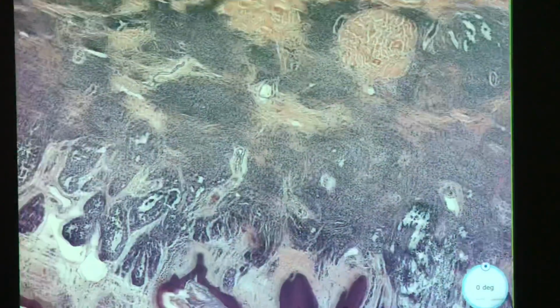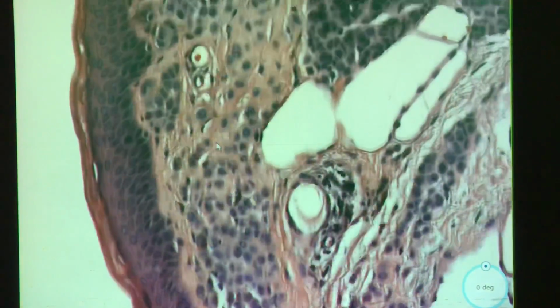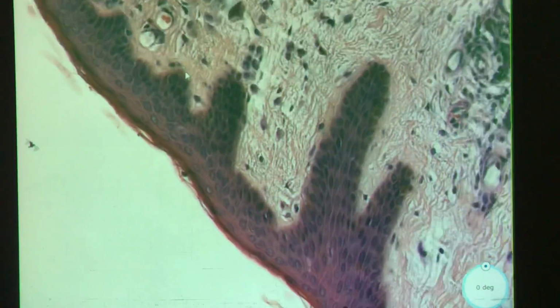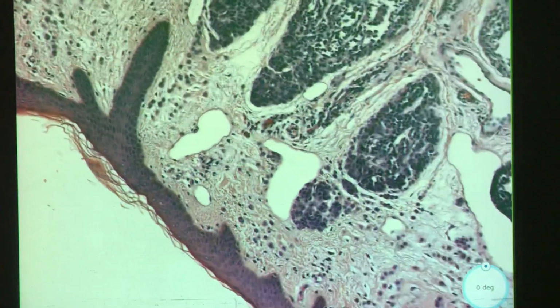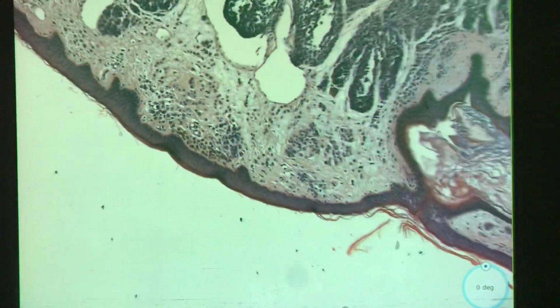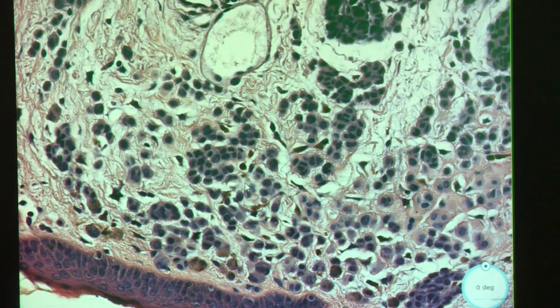So I guess the next question is, do you have an epidermal component? Not at low power. Maybe there's some, but no, not in the epidermis, just a dermal component. Not seeing much in the epidermis. Right, because we'd be looking for an actual nest. Normally you have melanocytes within your epidermis, but what we're looking for is nests within the epidermis. And I'm going to save you a little bit of time because they aren't there.